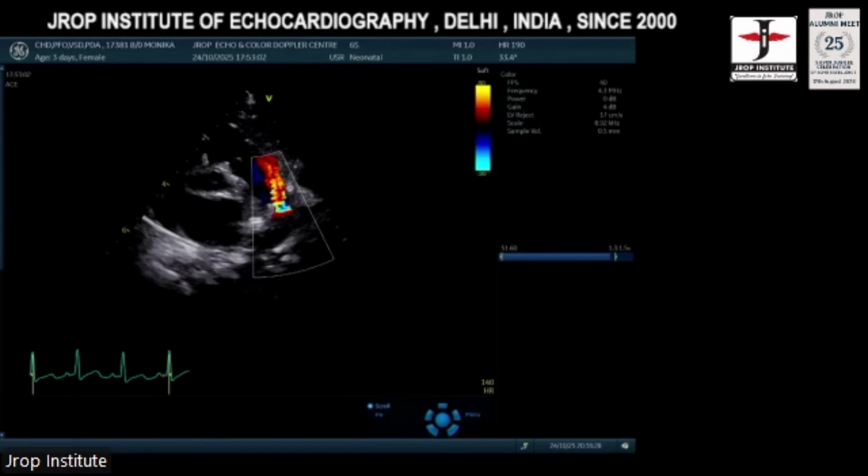So it's towards the transducer. Look at my screen over here. This is Nyquist limit. It starts with red and gradually becomes yellow. It starts with blue, gradually becomes sky blue. So you must have remembered your old physics. Violet, indigo, blue, green, yellow, orange, red. VIBGYOR. So I can change this baseline. Normally we keep these colors at a Nyquist limit of 60.